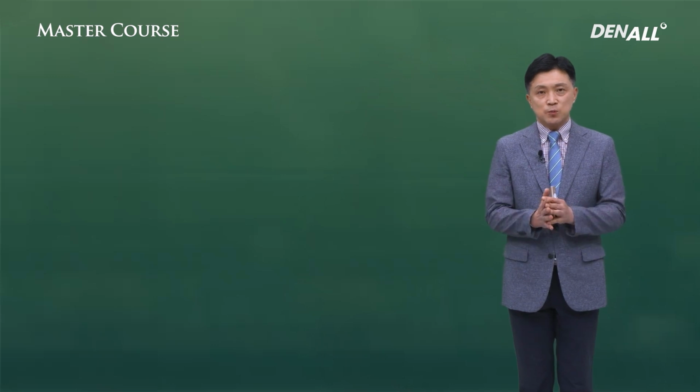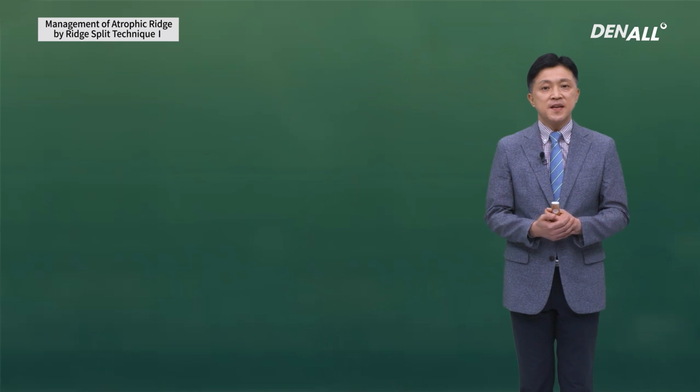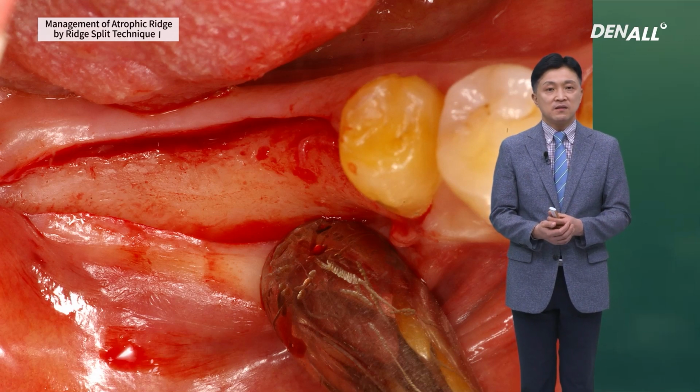Today I'm going to talk about how to solve atrophy of the ridge with horizontal resorption, and how to solve it using the EdSet kit. I'm going to talk about ridge split.